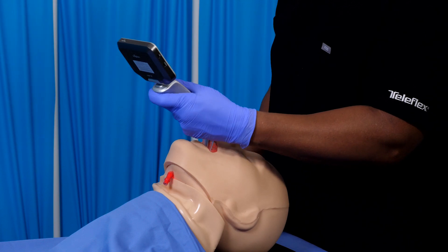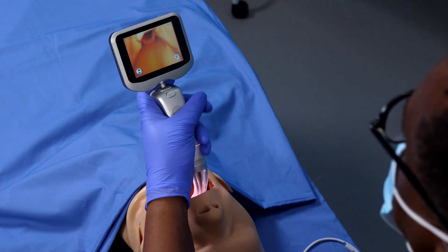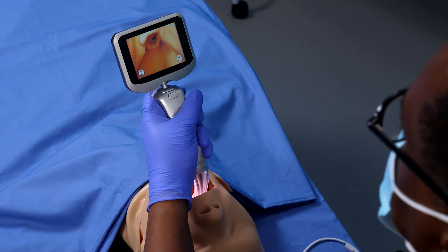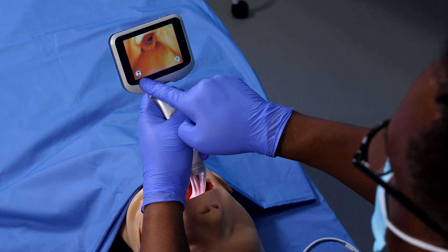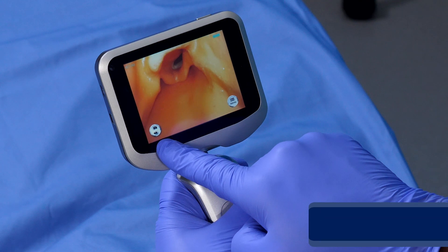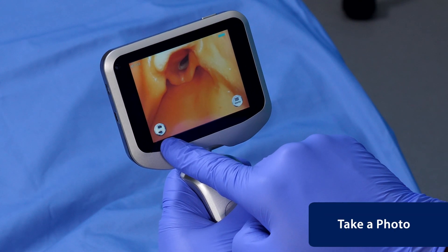The Video Laryngoscope supports photo and video capture and saves this data to its internal memory. To take a photo, quickly press the Photo Video button on the screen.